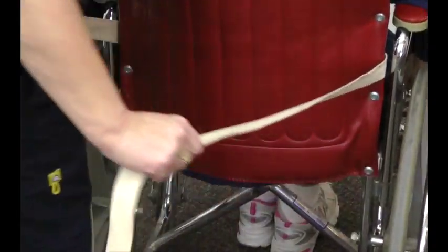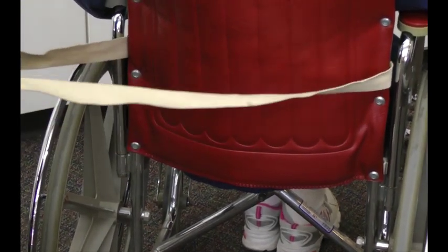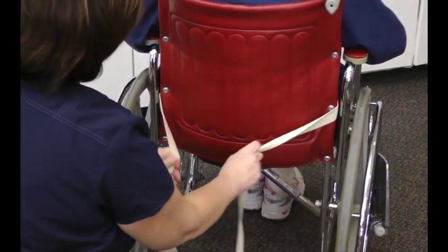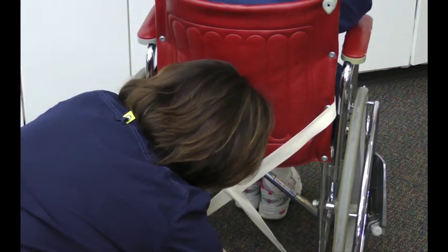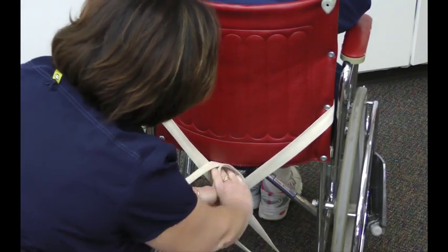Doesn't get tied to anything, okay? Not yet. What we have to do is, we have to get down here. Melissa, that's not too tight, is it? Go ahead and cross it right here. You bring it on the outside of the supports of the wheelchair. You bring it up here, and you have to tie a slip knot.